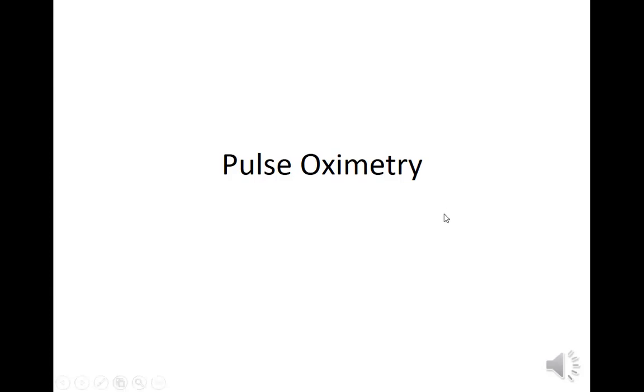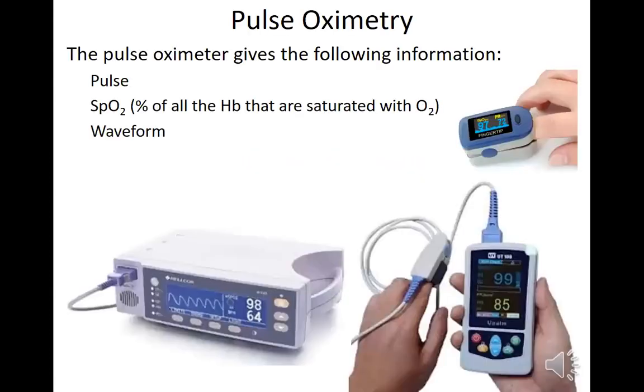So when we do CaO2, you'll see there's other values which we have to memorize. So this is the pulse oximeter that you could buy. Put this on your finger. It'll give you the oxygen saturation on the hemoglobin. That's the 97%.